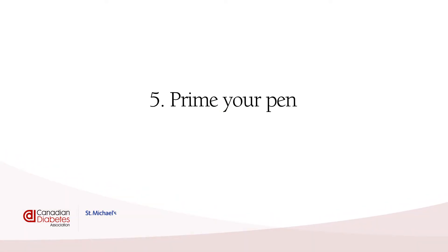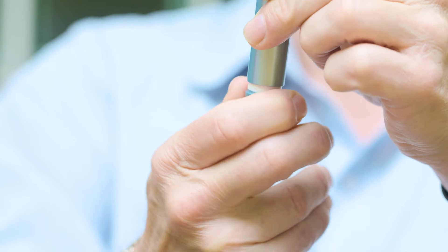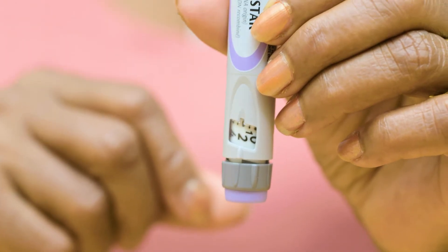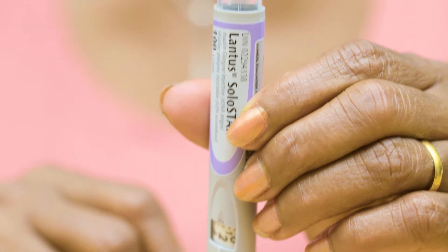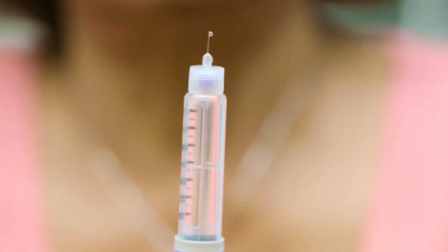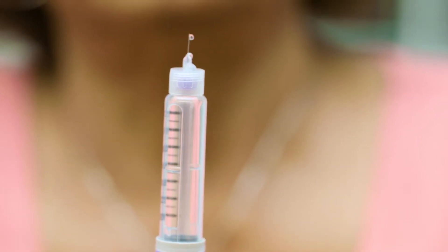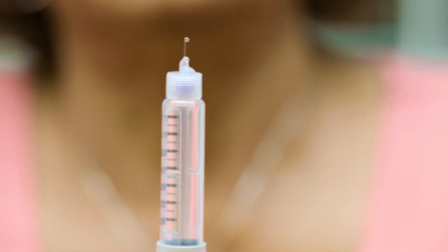Prime your pen. Priming the pen just means getting rid of the air in the needle and making sure that the pen is working. To do this, first you will dial two units. Now hold up the pen and press the injection button all the way in. Look for a few drops of insulin. If you don't see any drops, repeat the above steps until you do. Once you do, your pen is primed.